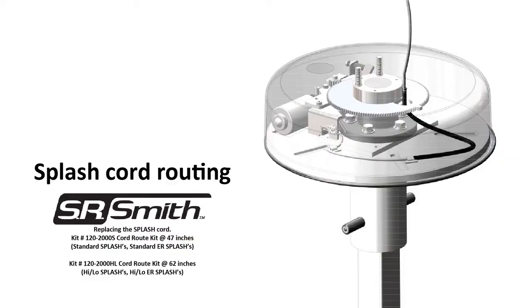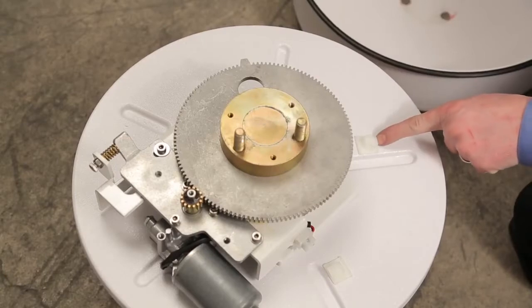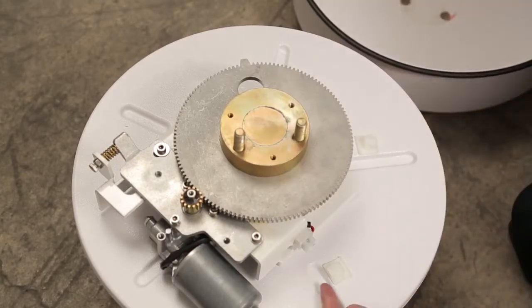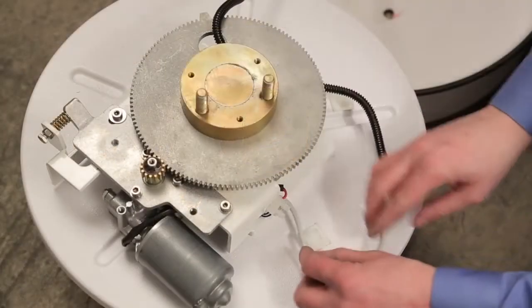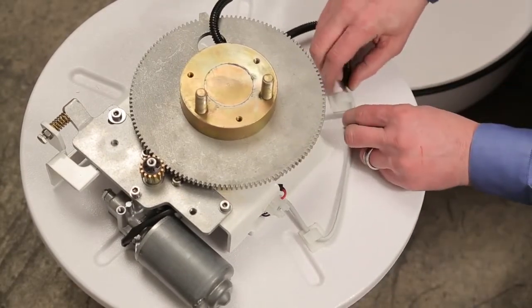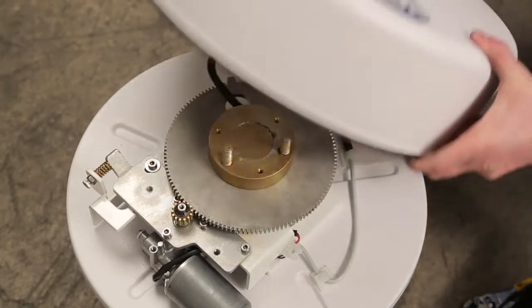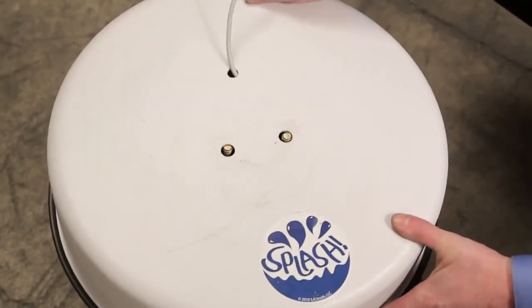When replacing the motor cable on the splash lift, follow the directions included with the replacement cable kit. Routing the cable in this manner will help prevent the cable from being entangled in the gears. Thread the cable through the opening in the lift cover, then replace the cover on the lift.